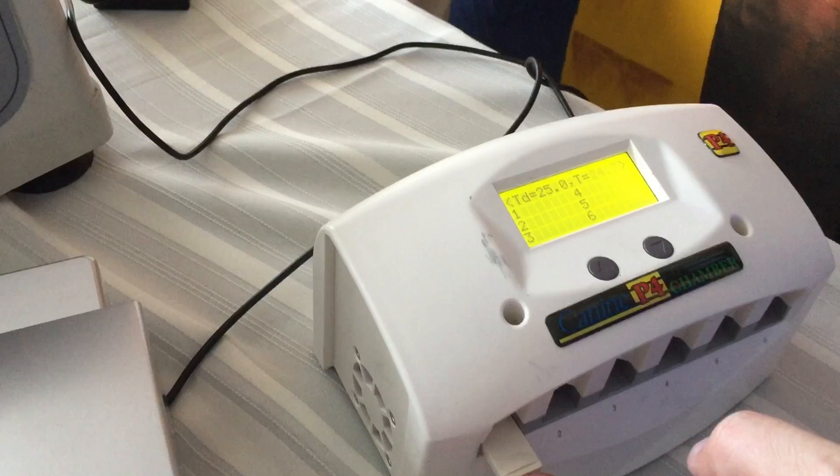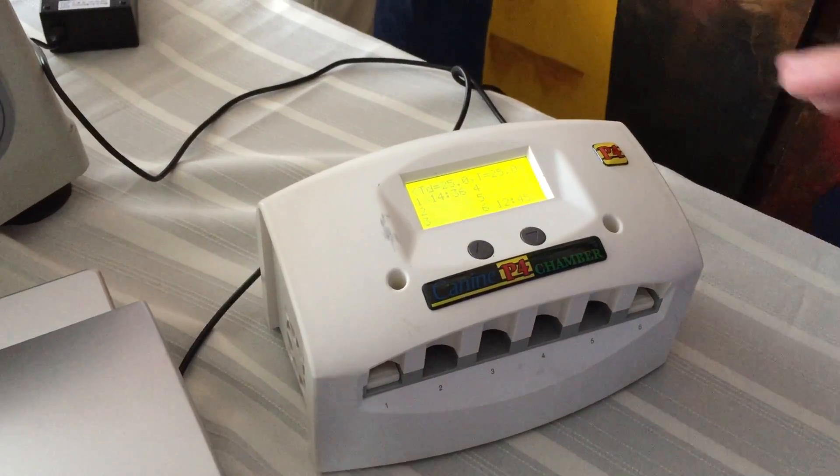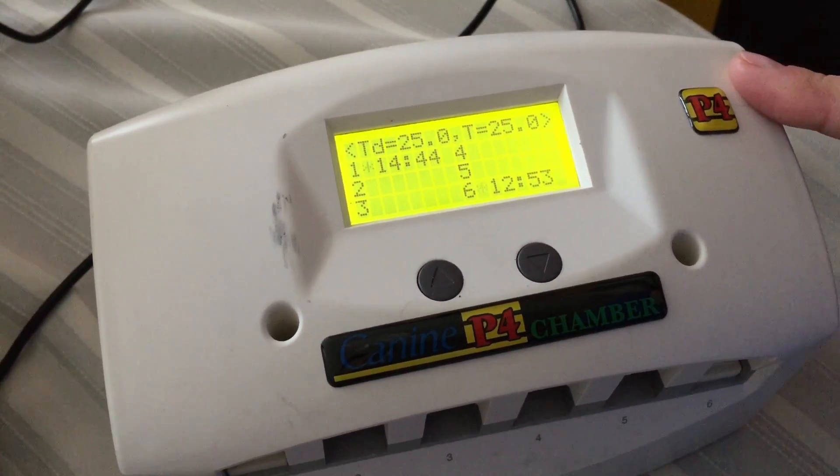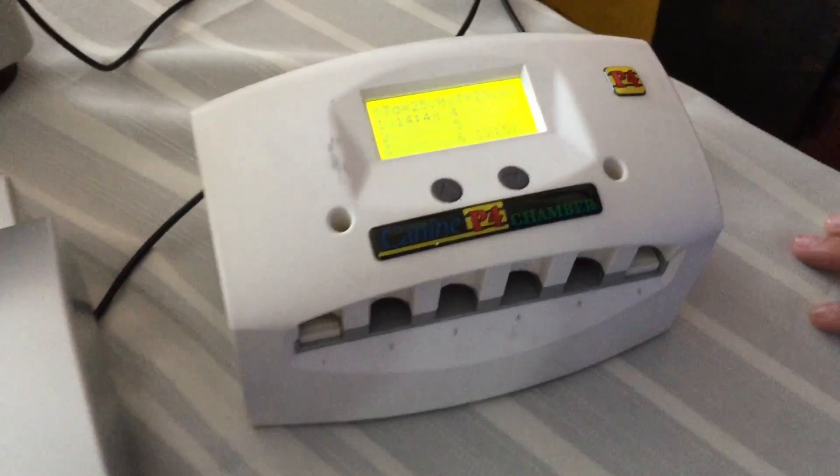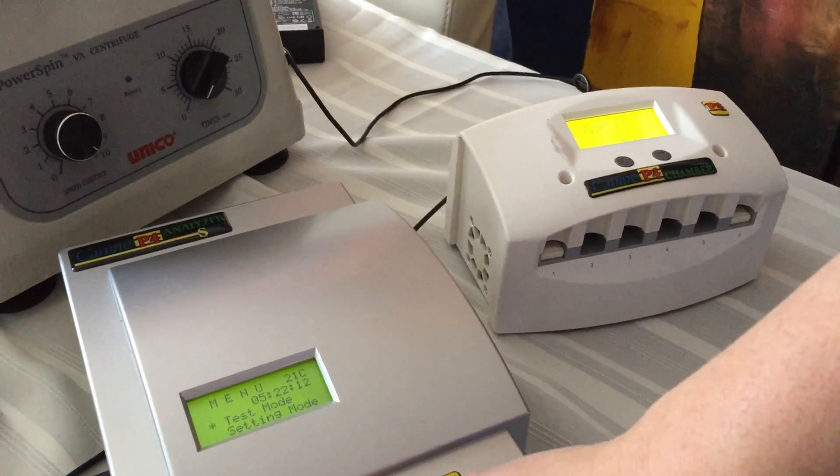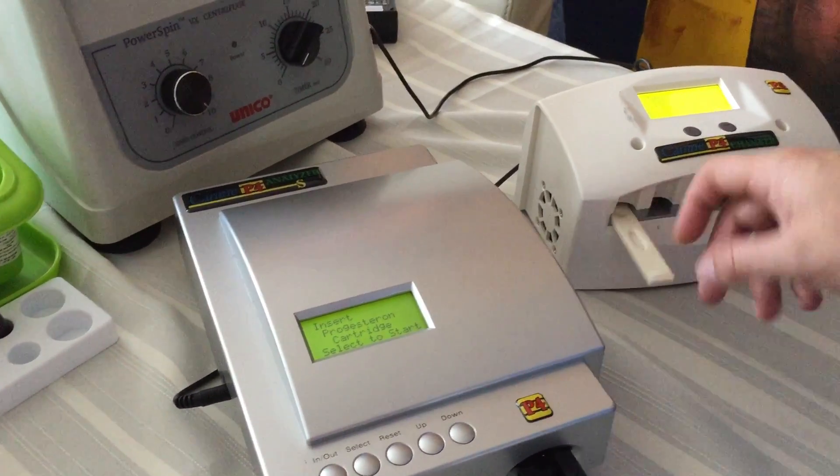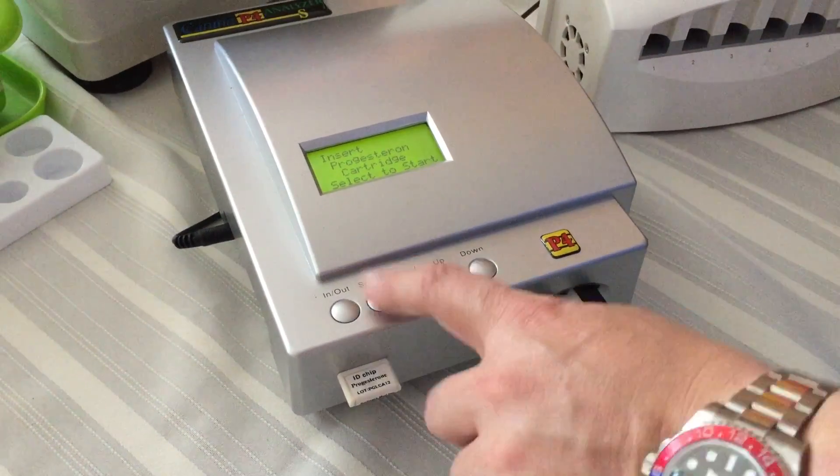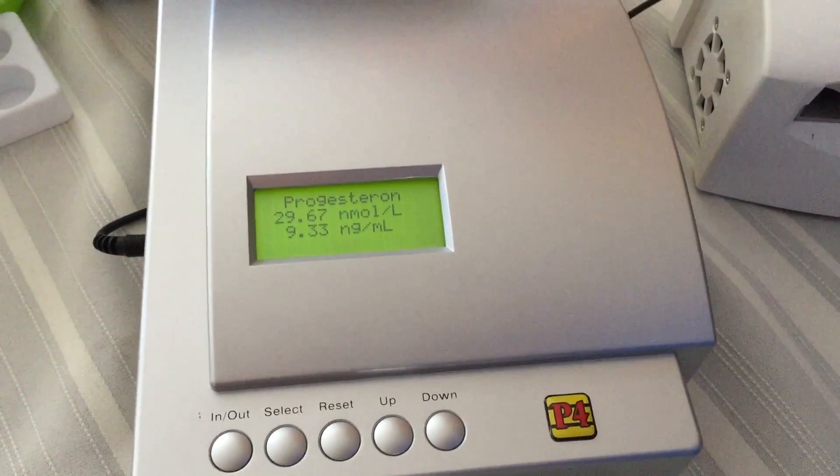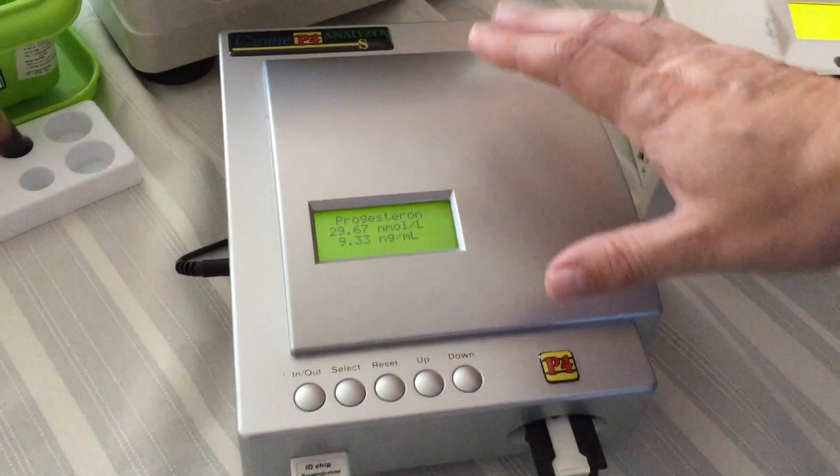Okay, so we've been documenting the progesterone levels for the past three days. Three days ago was 1.48, yesterday it was 2.47, so that means she is about to ovulate. And today we're gonna see what her levels are. Okay, so here's the test. Let's select and let's see what she's on. Alright, so she already ovulated. She went from 2.47 to 9.33.